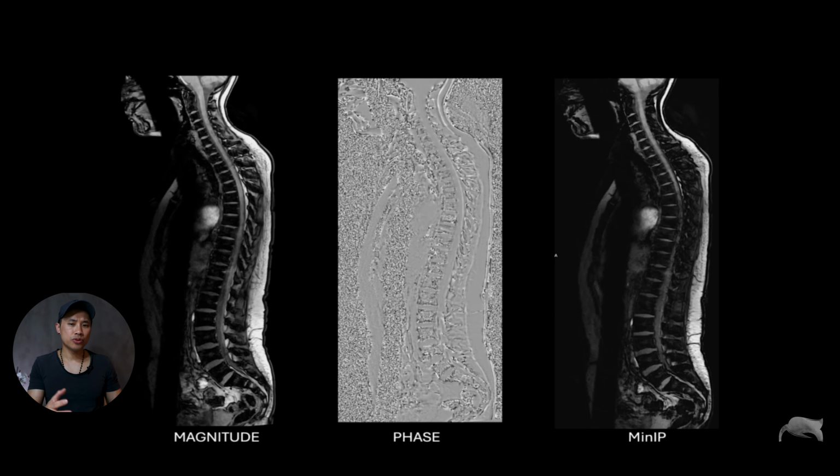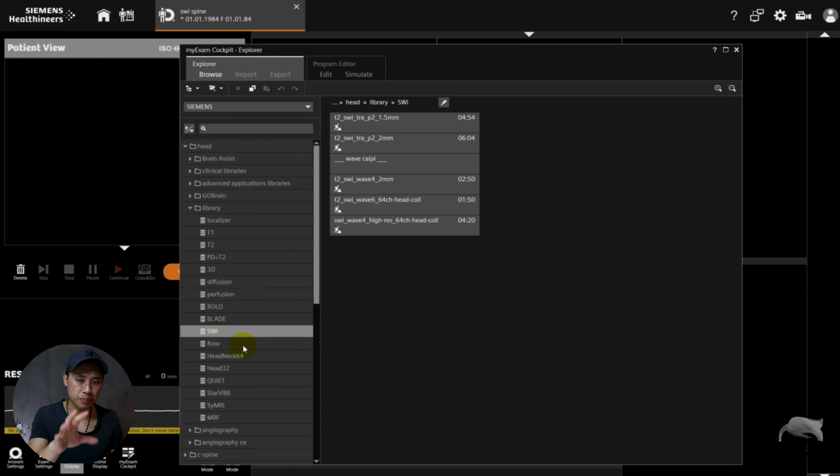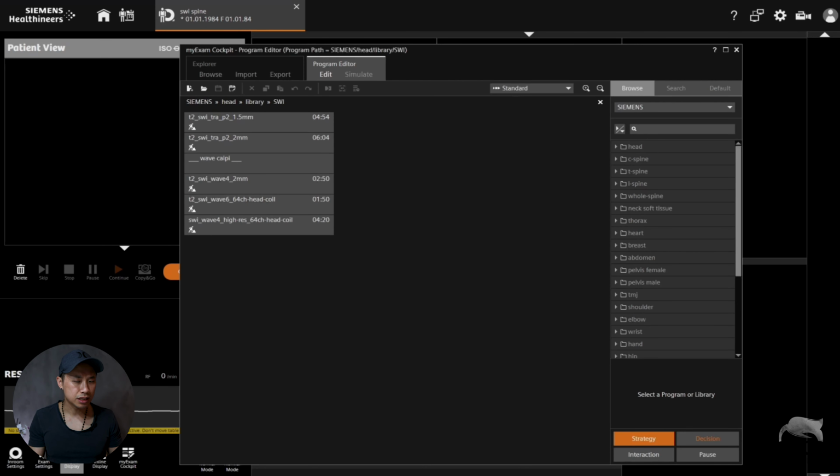Right, so let me show you the technique of how you can compare two sequences and then build them and so on. Let's go to Siemens Tree right here, the library, from the head. We know that there's an SWI for the brain there, which works great. So let's just take one of the axial ones, and we go to the editing program. These are the sequences available on Siemens Tree. So whatever I'm doing now, I just drag over the one I just used so we can do a comparison.